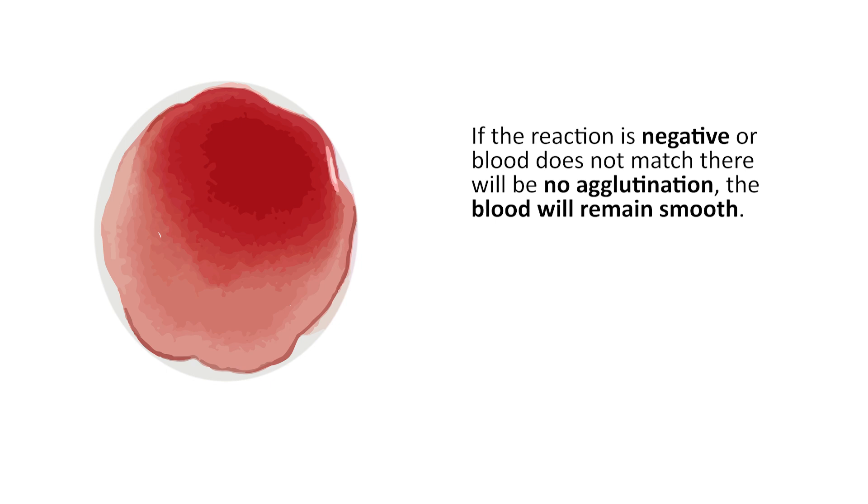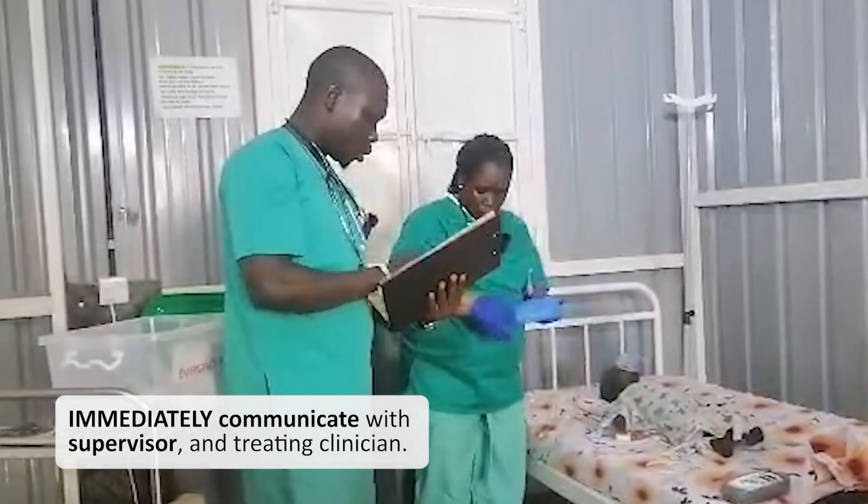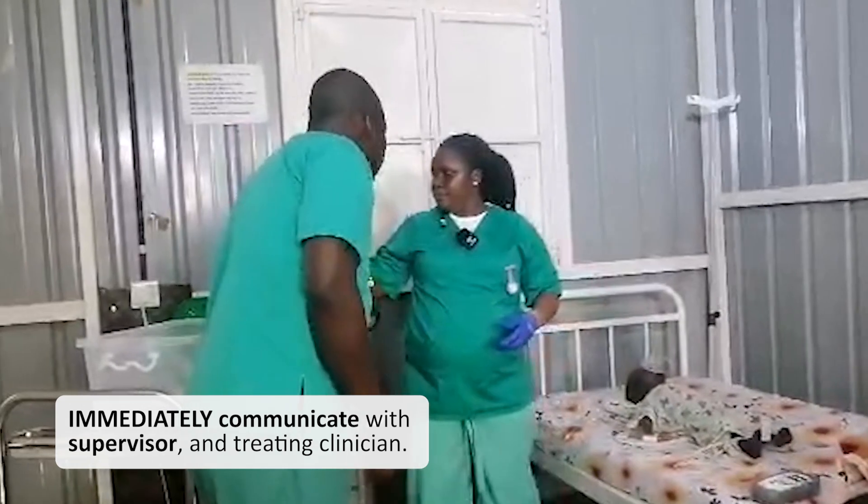If the reaction is negative or blood does not match, there will be no agglutination — the blood will remain smooth. If the recipient's Serifol card reactions do not match the donor reactions, do not transfuse. Immediately communicate the concern to your supervisor and the treating clinician.